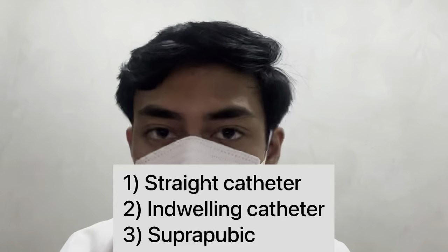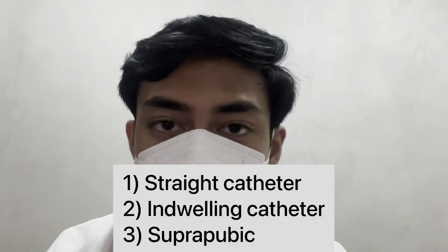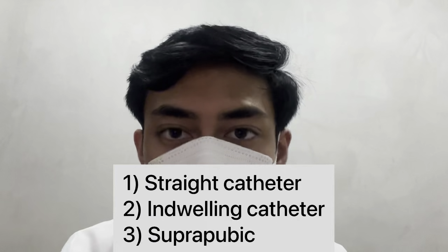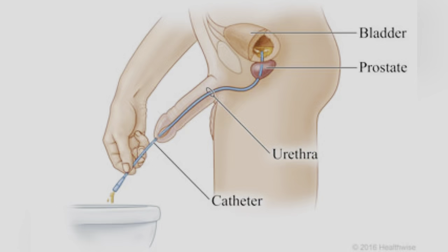The first is the straight catheter or French catheter. The second is the Foley's or indwelling catheter. And the third type is called the suprapubic catheter. The straight catheter is inserted into the patient's urethra until it penetrates into the urinary bladder. As you can see in this picture, the catheter is inserted into the urethra until it reaches the bladder. Once the urine inside the bladder has been removed, the catheter must also be removed.